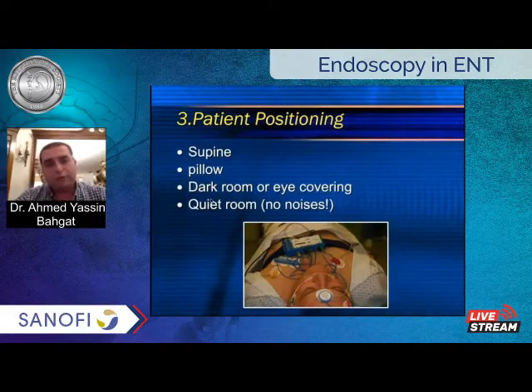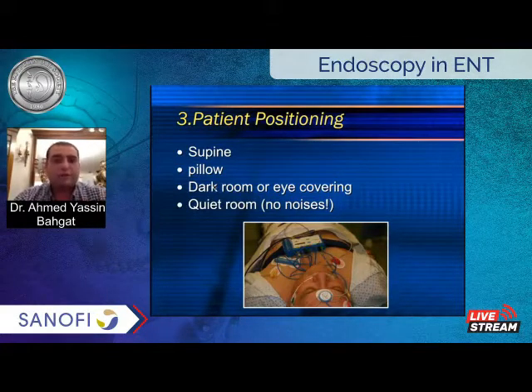We put the patient in supine position on his back with a comfortable pillow under his head. It's better not to use the OR table. It's better to put the patient on a comfortable bed, in a dark, quiet room, with his eyes covered. So you are simulating the environment of sleep so that the patient may go into sleep without giving him a lot of drug to induce his sleep.